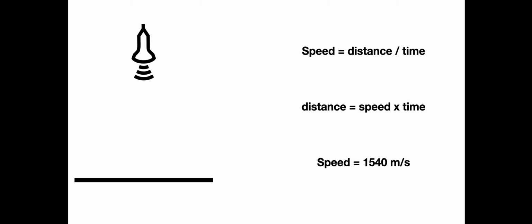With transducers, it's the same sort of thing. So this sound wave goes off to the surface, is reflected and comes back. And if we know the variables involved in the basic equation of speed equals distance over time, we know how long it's taken for that pulse to go away from the crystal or transducer surface, be reflected and come back. We know that by inference, distance equals speed times time, and we've inferred that the speed of sound in soft tissues is 1,540 meters per second. It'll move faster in bone and relatively slower in air.